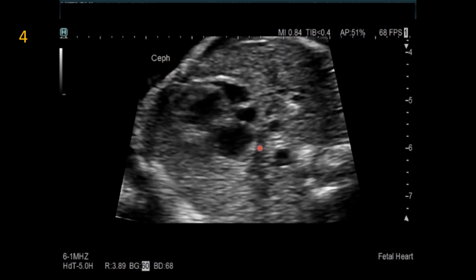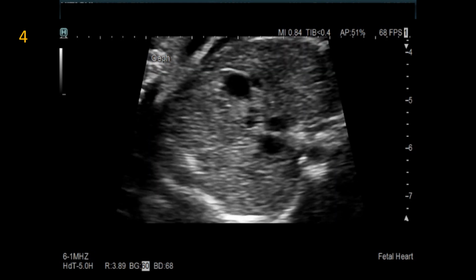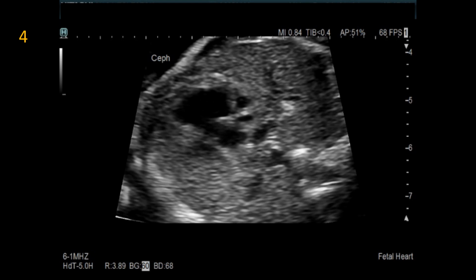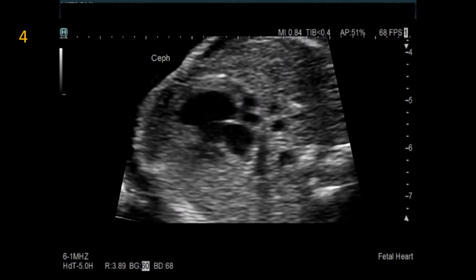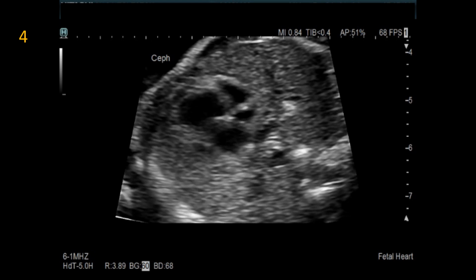They drain to a confluence that's posterior to the left-sided atrium. And when we look at it closer, freeze it and scroll, we can see that these veins join that confluence clearly there without connection to that left-sided atrium.